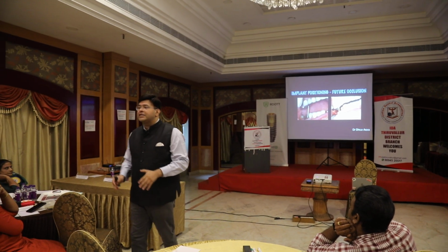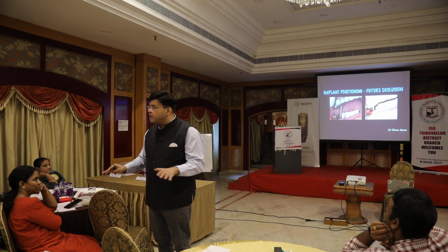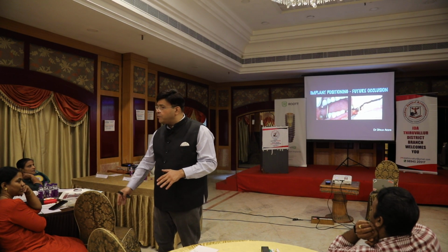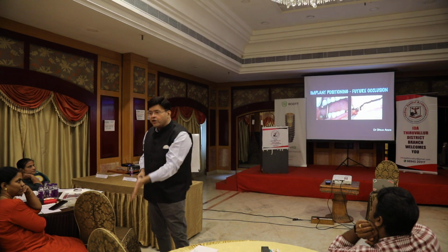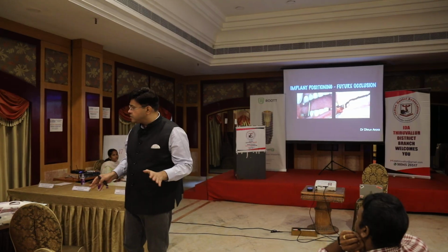In the mandible, there is no straight implant. You do not put a straight implant. An implant will always be at a buccolingual angle because the implant has to hit the palatal cusp on the top. If I am putting an implant in the maxilla, it should come down and hit the buccal cusp of the mandible. So there are no straight implants.